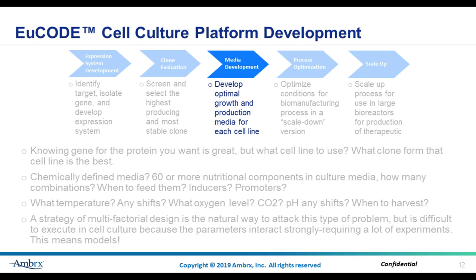After the cell line, there's perhaps no other factor like the culture medium that can more greatly influence process performance. Once a successful growth and production medium for each cell line has been developed, the culture medium formula and the details of how it was developed are often two of the most closely guarded secrets of the manufacturer. It indicates how important medium development is to overall process development.